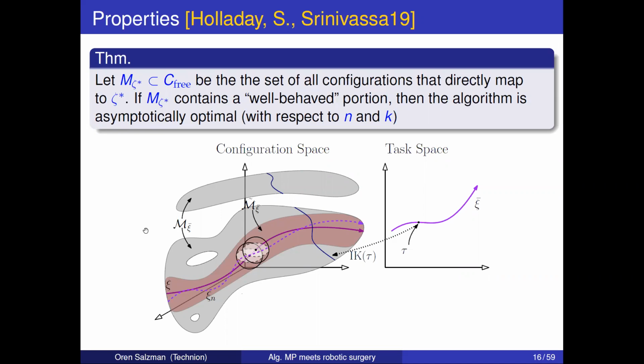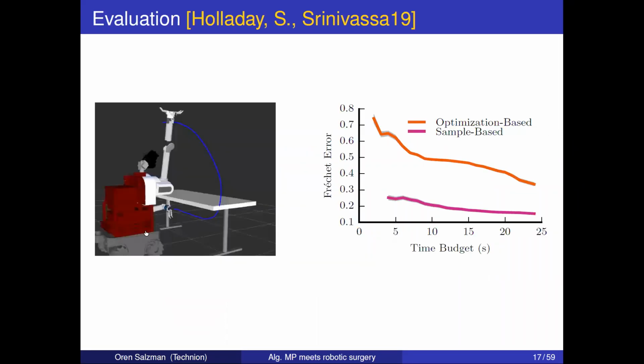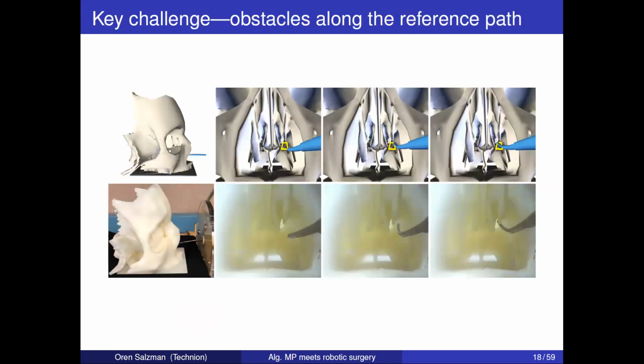And we were happy and we published this work. And then we came to apply it on the medical domain, and we got garbage. Sorry, before the garbage. It did outperform everything, the optimization-based algorithm that solved this problem beforehand. And this is an example on Herb, which is one of Sid's robots. But really for the medical domain, which is what we care about, things did not work.